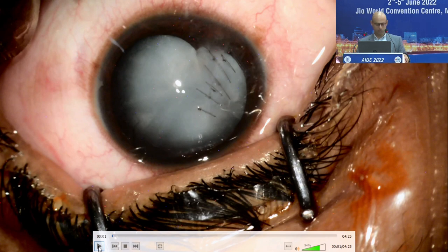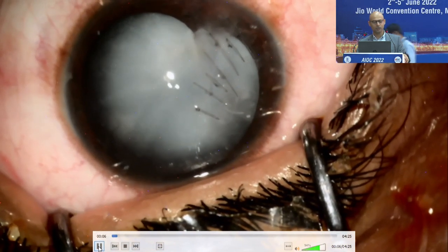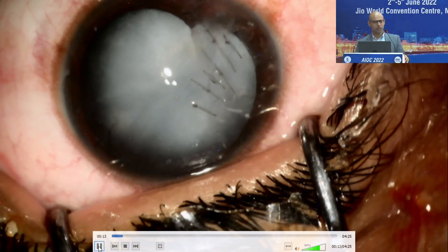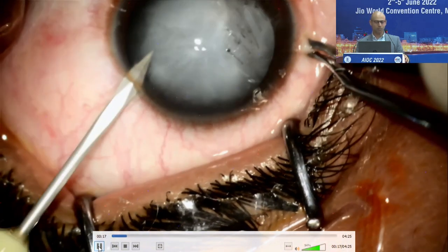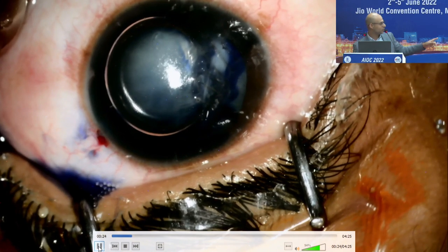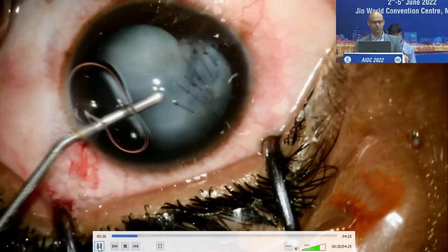So this is what we did. It was time to do a cataract surgery for this particular patient, so the dilemma was whether to just remove the cataract and put the lens secondarily after removing the sutures, but since the suturing had not been done very well, I decided to go ahead and put a lens primarily and spare the patient another surgery. As you can see, when we put the air bubble, it's not going through in the inferior area, so I was a bit suspicious that we might have some vitreous going to the wound in that area.